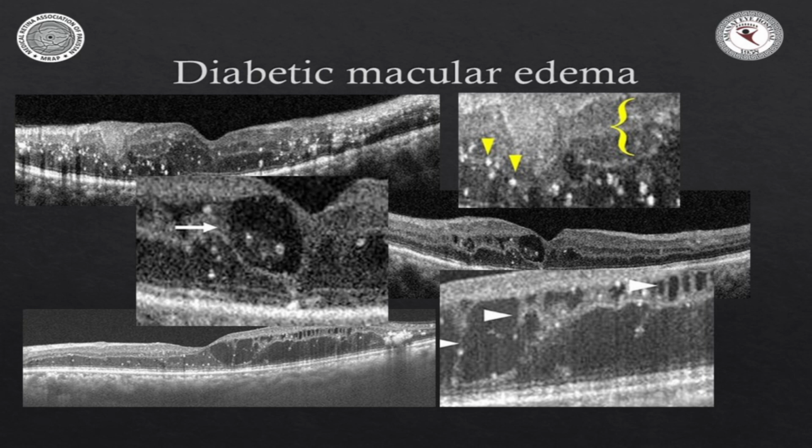Don't try and make a lot of promises to this person over here, because the ischemic component is predominant in this case, although it will respond to anti-VEGF. But there is a lot more here that is going to compromise your final visual outcome. तो ऐसे केस को कहना चाहिए 3 टीके लगाएंगे बिल्कुल ठीक हो जाओगे आप लोग, 100% आपकी विजन वापस आ जाएगी. From day one, I know that this is not the case.